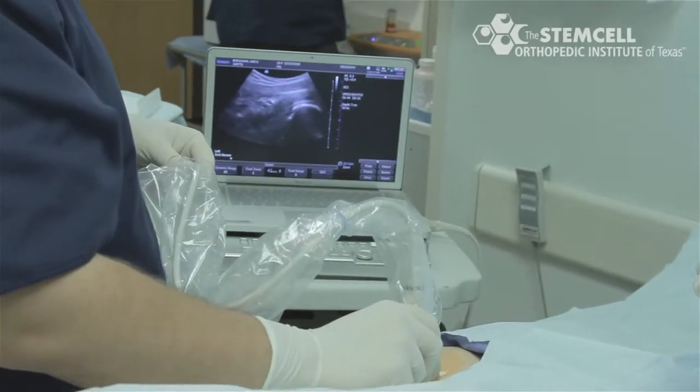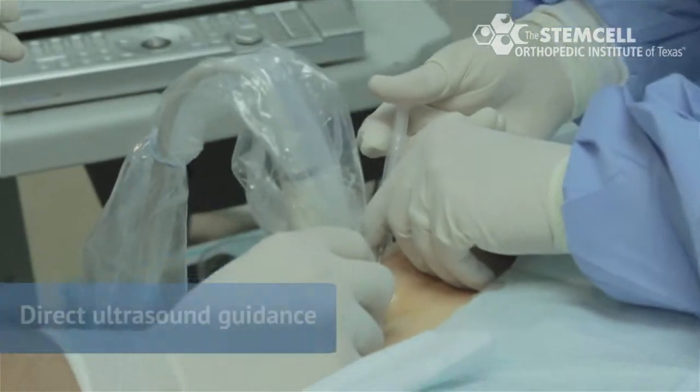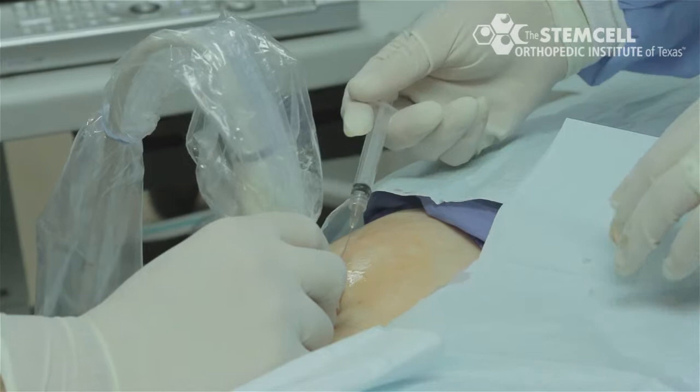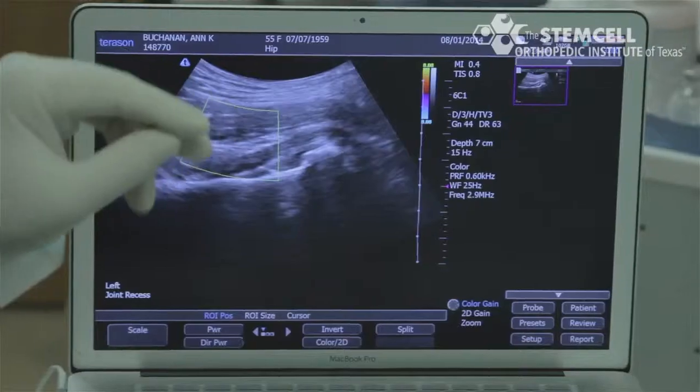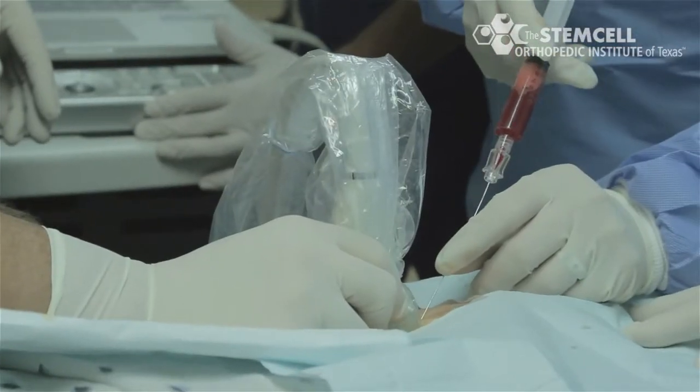The skin is sterilely prepped and draped over the left hip. A needle is placed under direct ultrasound guidance down to the capsule of the hip, where the patient is injected with the stem cell concentrate. This is then followed by an injection of platelet-rich plasma.